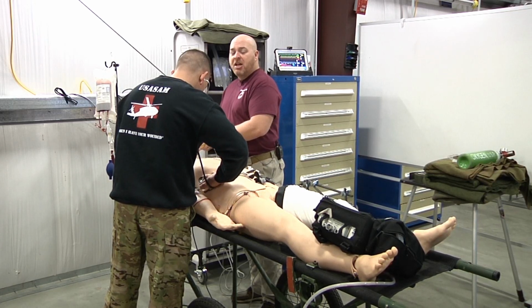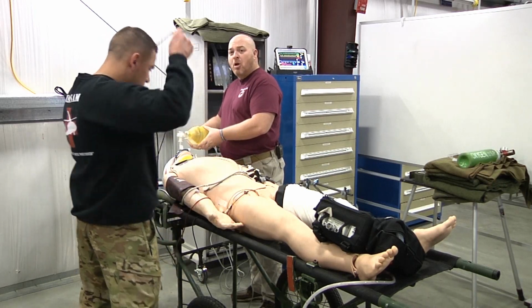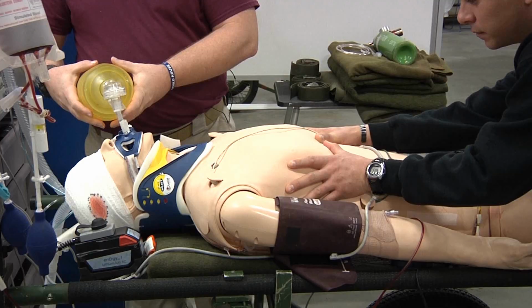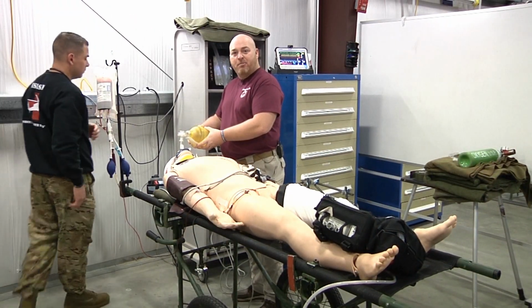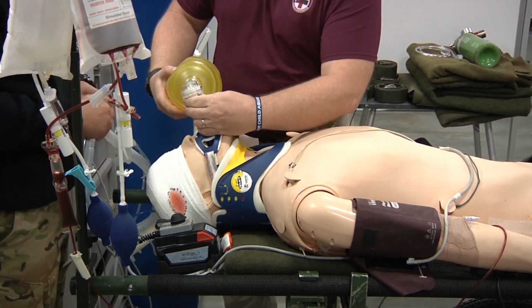In the aircraft, it's very common for you to second guess yourself. If two people know what right feels like, then you're less likely to make an error in judgment. After we have both completed our assessment of breathing, we're going to place the patient back on the vent.